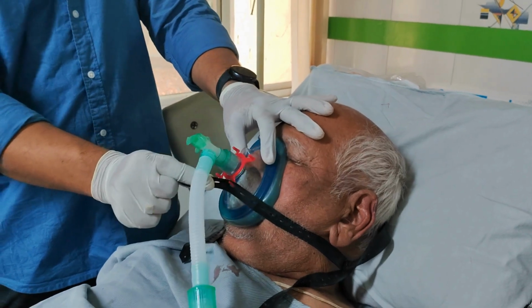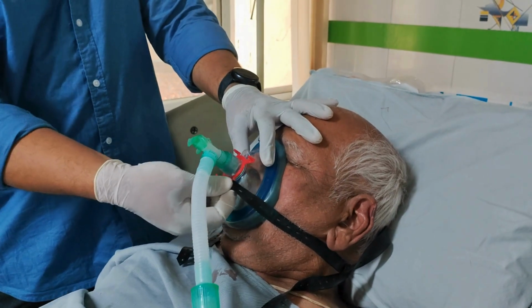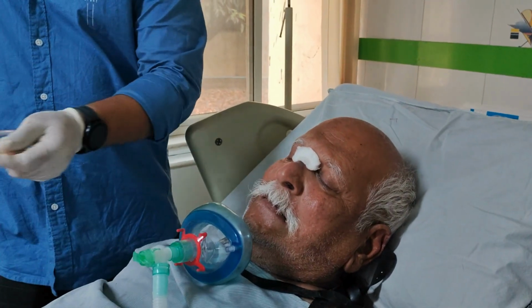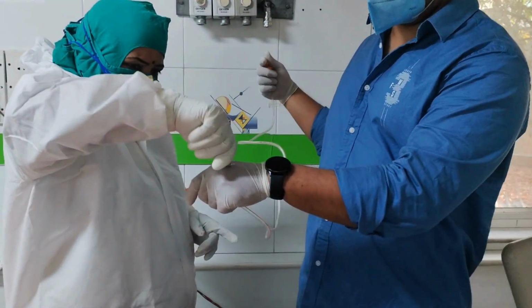Inserting a Ryles tube in an agitated patient on NIV support is a delicate process, but it's essential for their care. Let's walk through it step by step. First, we carefully remove the NIV mask, but make sure you're closely monitoring the patient's vitals throughout the procedure.